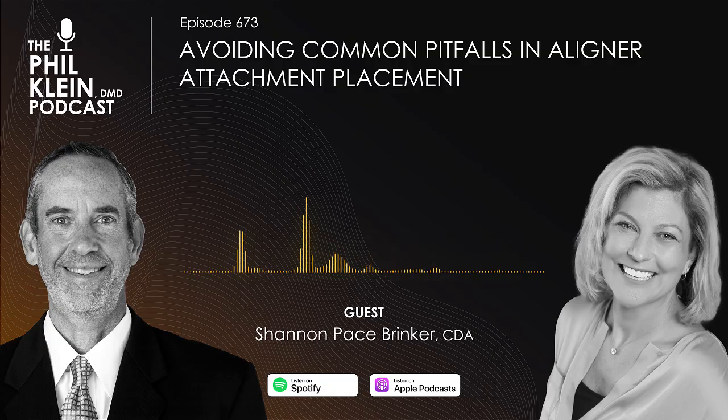So what do you recommend? What do you recommend for isolation that you really swear by? My go-to number one is OptraGate. Every video, you can go back 10 years, 15 years, every video for isolation when it comes to attachment placement is the OptraGate. And they now have the OptraGate 2, which is even better.